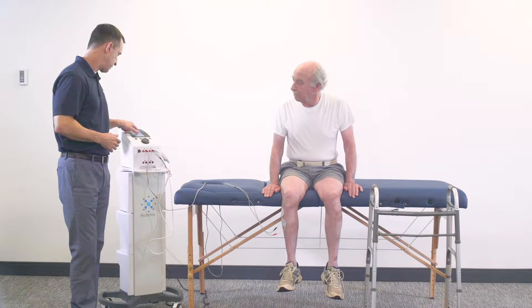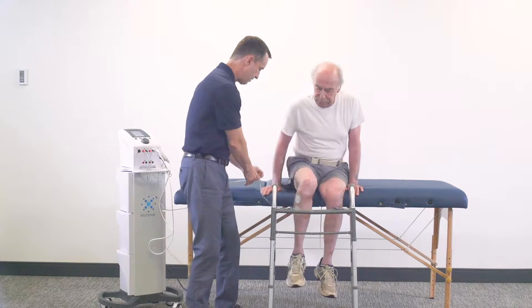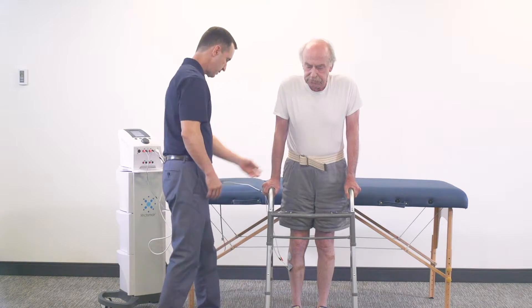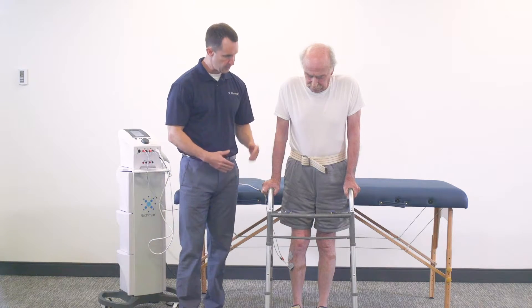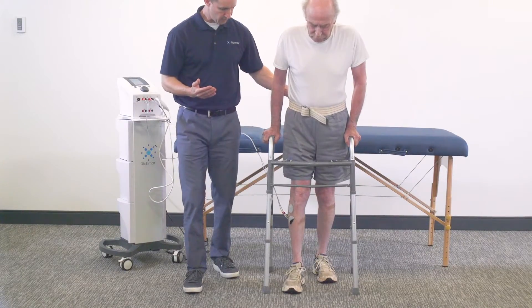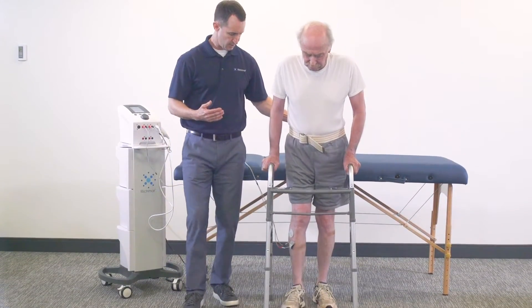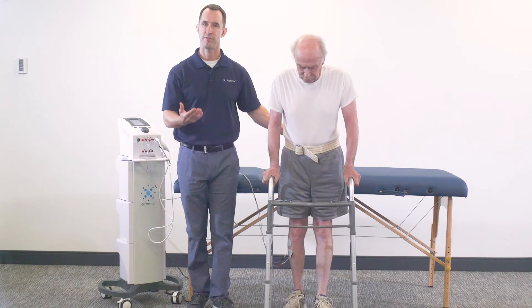I'm going to pause the treatment — that'll shut down the current flow. I'm going to pull the walker over in front, have him slide down, and hold on to the gait belt. Now I'm going to turn the unit back on. It'll cycle back up until he gets a strong dorsiflexion. We're going to have him take a step forward and then a step back, shifting his weight to the right side as he steps forward and back to the left as he steps back — following that same pattern several times. And that's how you can progress from a seated to a standing position and more functional movement.